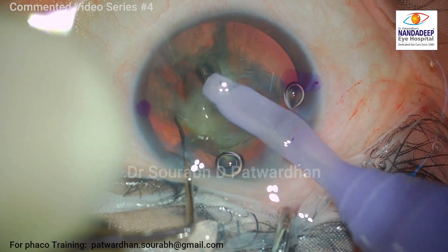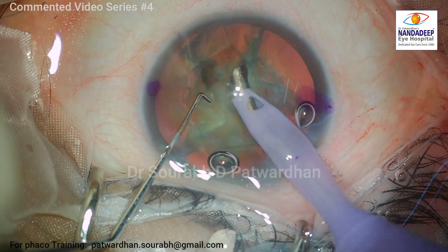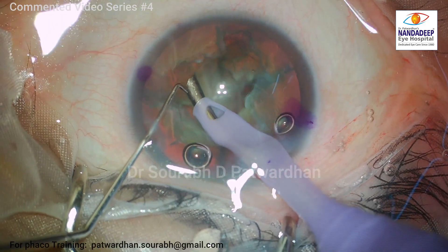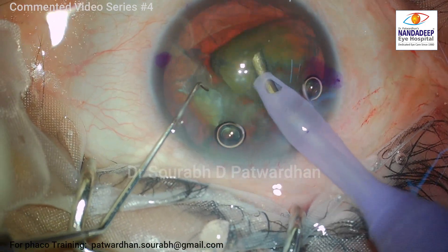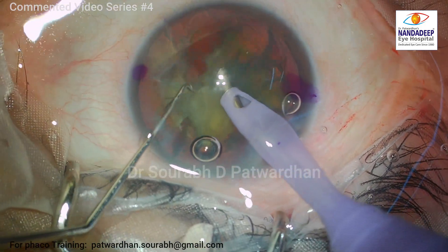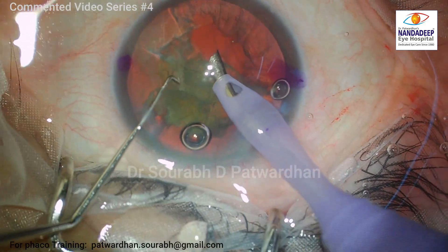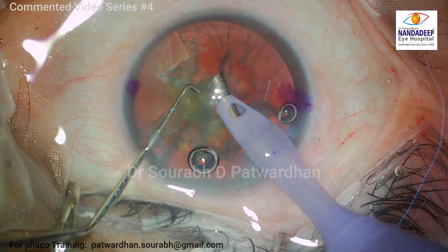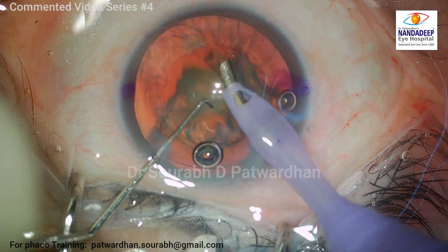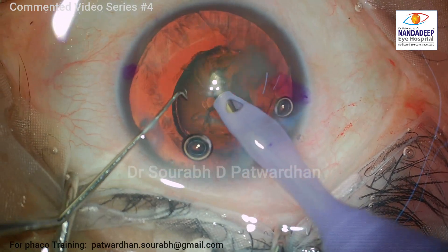Once the trenching is done, you can see that I could easily divide. Another advantage of trenching in this case is that I did all the trenches with just 40 cm of bottle height. For high myopia, it's a nice way to do it because you are not raising the intraocular pressure much. These eyes may have lower scleral rigidity, and higher bottle height may lead to more deepening of the anterior chamber. It might also be uncomfortable for the patient, as most of these cases are done on topical anesthesia.